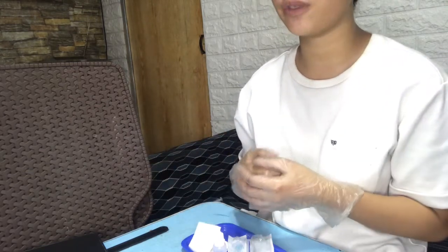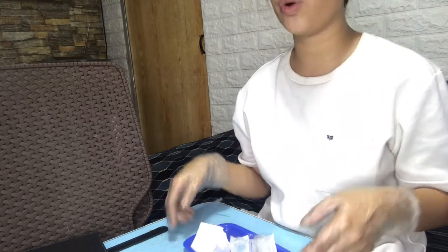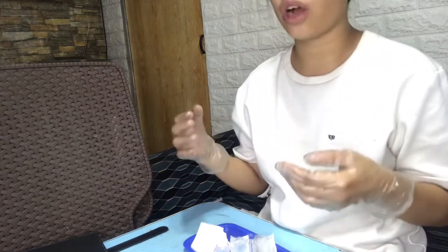Perform hand hygiene and observe other appropriate infection prevention procedures. The rationale for that is not to spread any microorganism to the patient as well as to the medication. As you can see, I already have my hand washing, and I also put on my gloves. Next, prepare the medication ampule for drug withdrawal.